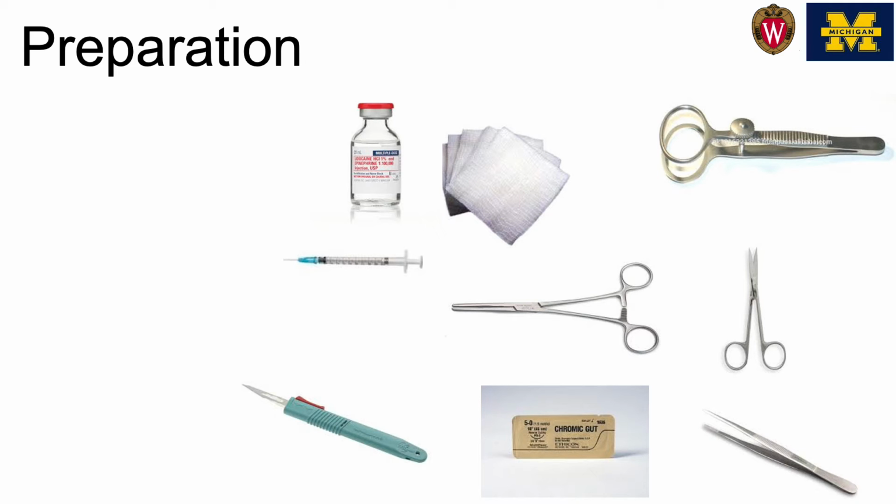The clamp is something that some people use regularly during procedures. I only use it rarely for hemostasis, and the reason it is rarely required is that if you allow the lidocaine with epinephrine to dwell for 5 minutes or so after the submucosal injection, then you really shouldn't need the chalazion clamp because you should have adequate hemostasis in the vast majority of cases. That being said, I do have one in the room just in case I need it.